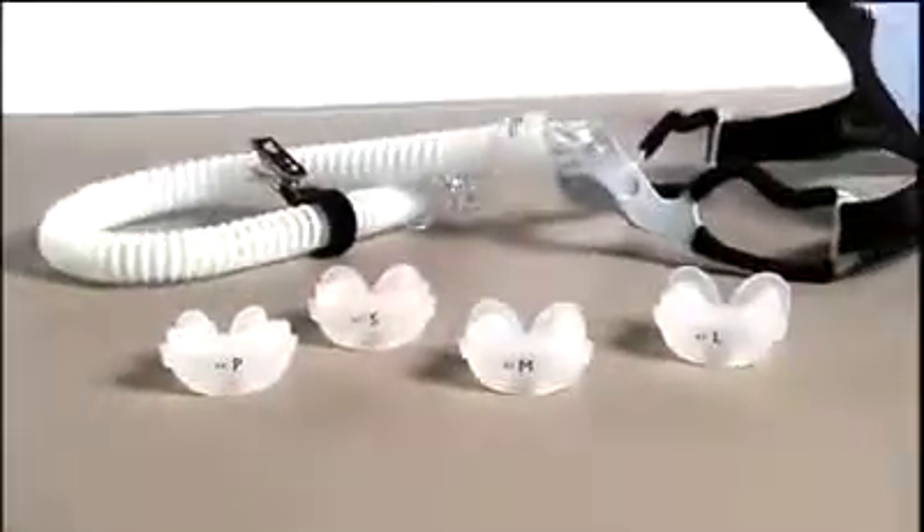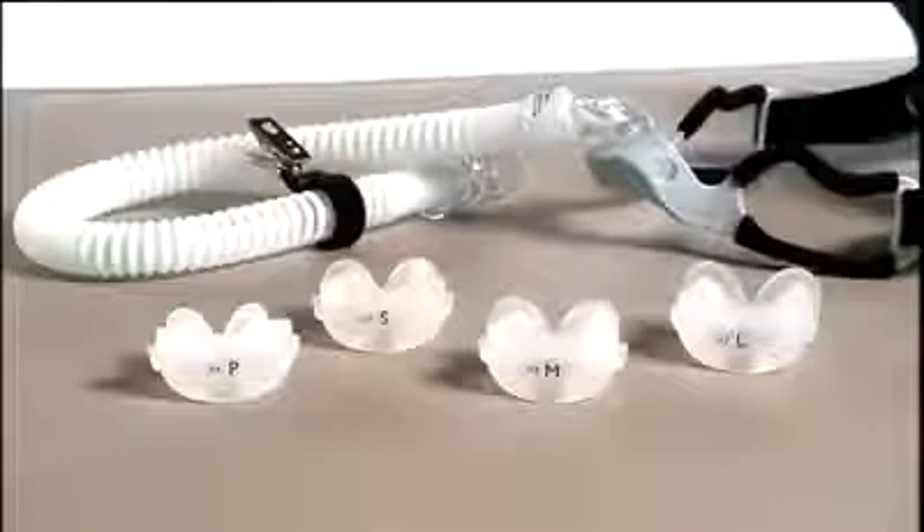The Go-Life mask has four cushion sizes: petite, small, medium, and large. The size is indicated on the bottom of the cushion, along with the Philips Respironics System 1 resistance control setting.